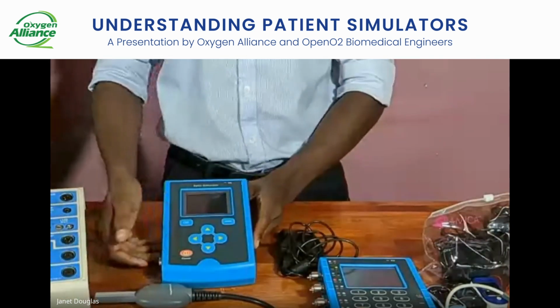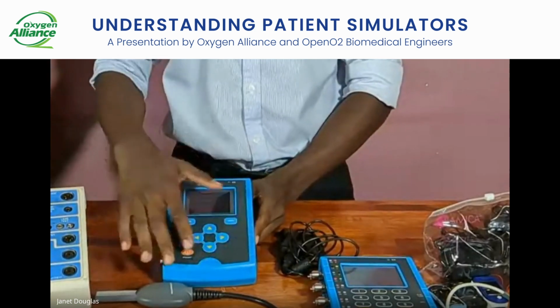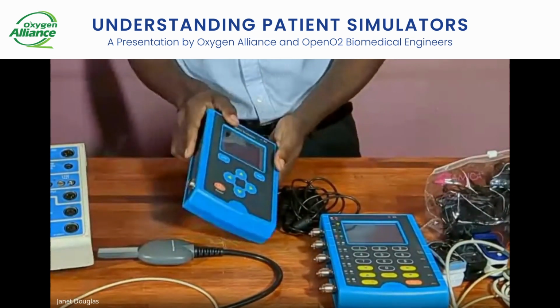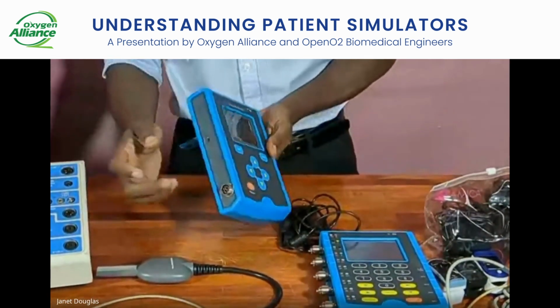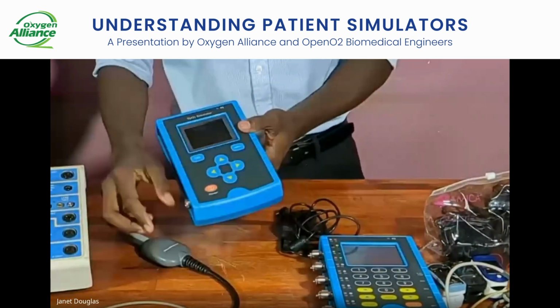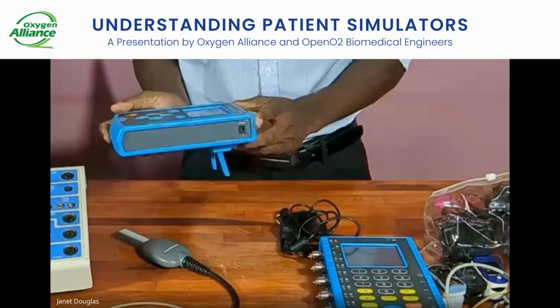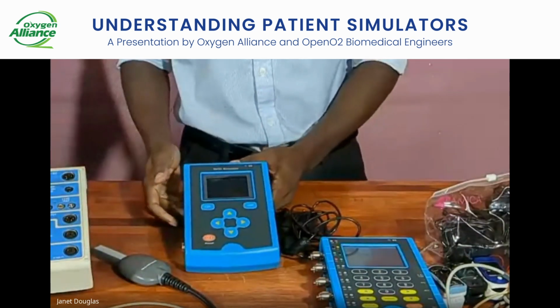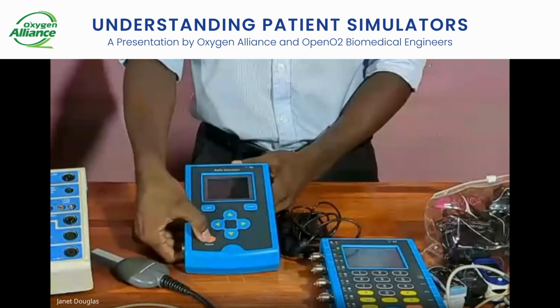First of all, you have these different keypads. Before we get to the keypads, you have this port where you connect the probe. Then you have this port where you connect the power adapter. If you want to power it on, you press the power button.